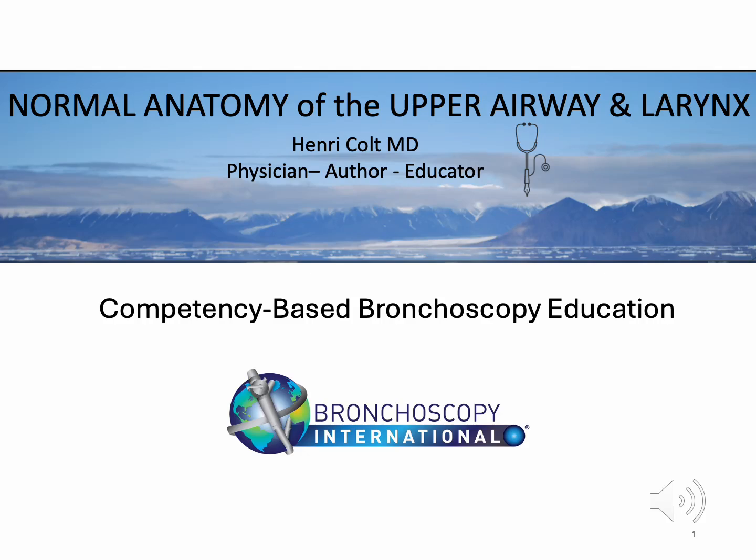I am Dr. Henri Colt, and this presentation is part of Bronchoscopy Academy, an ongoing competency-based curriculum in flexible bronchoscopy. The goal of this work is to improve procedural understanding, anatomical recognition, and clinical judgment while helping reduce patient suffering associated with unequal expertise and inconsistent training.